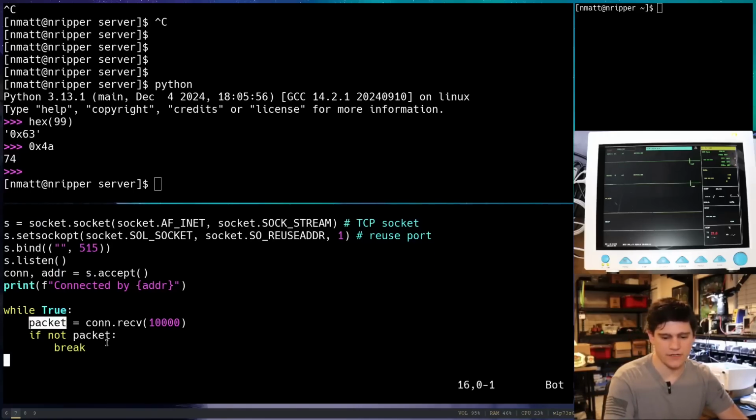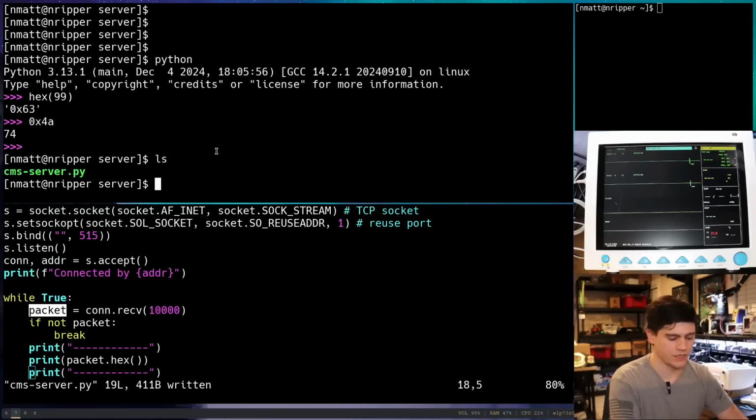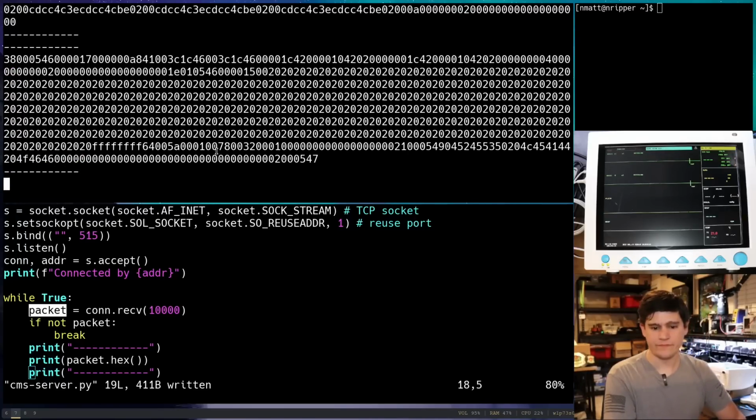And so what we're going to do here is just print out packet.hex, and then surround this with something that's going to make it easy for us to see where the delineation between different packets is. There we go. And so now we're going to run our little program here. And again, we're going to have to run it as root because we're listening on port 515. So there we go. That data is rolling through.